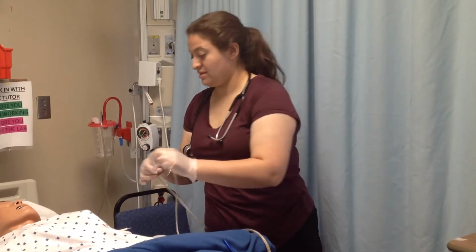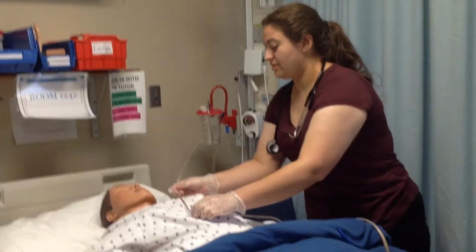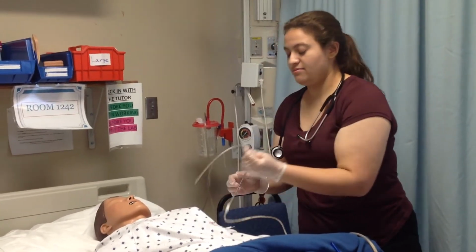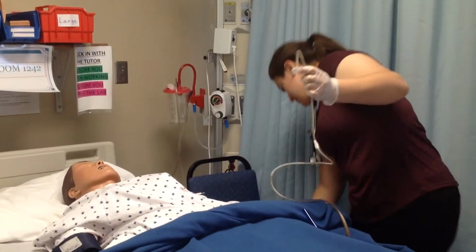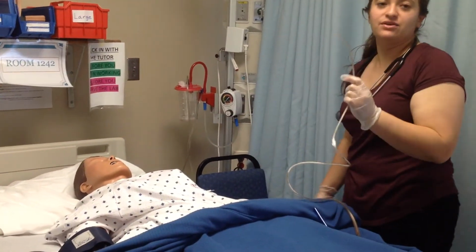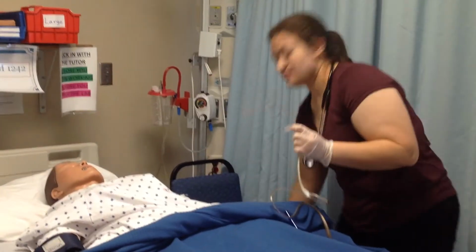Okay. And then first I would want to take this and hold the tube, and I'm going to lift the patient 30 to 45 degrees.